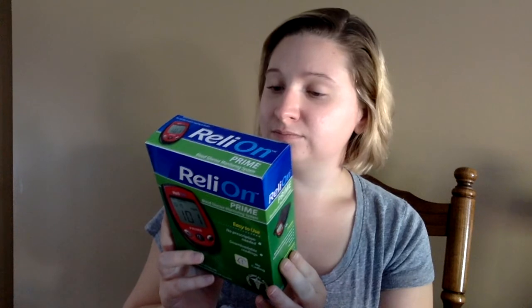So I decided to do the Relion — I don't really know how to pronounce it, but it's the Walmart brand. This was about nine dollars. The thing about this is it doesn't come with test strips, I don't think, or a lancing device. So it only comes with the meter, but let's open it up and see what it is.